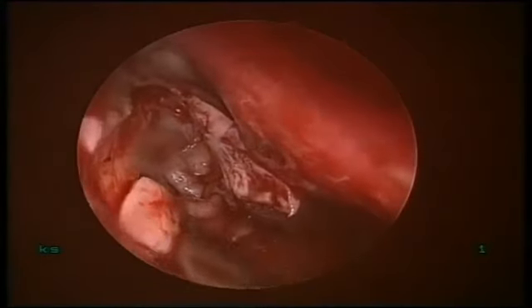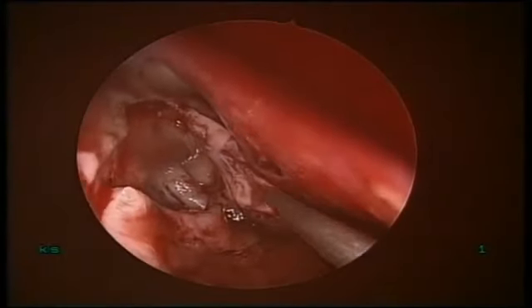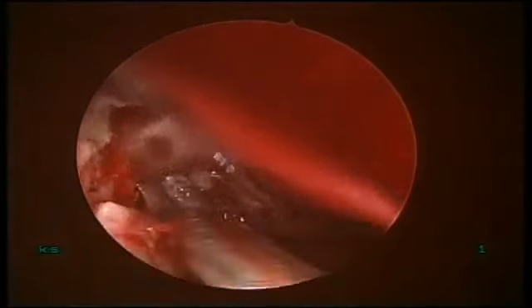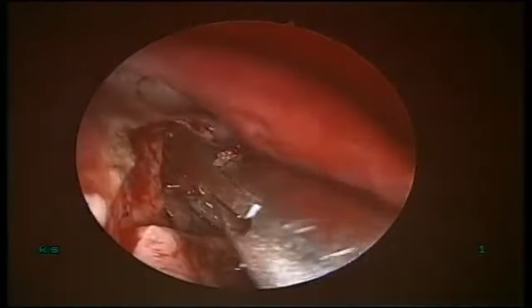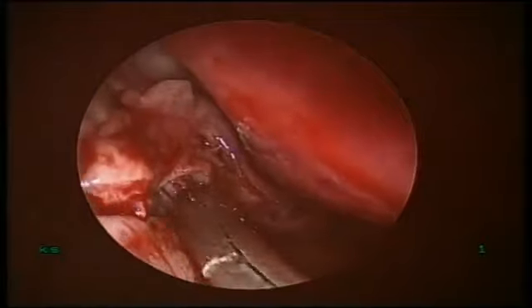Okay, the lower is going to come here and the upper one is going to come there superiorly.